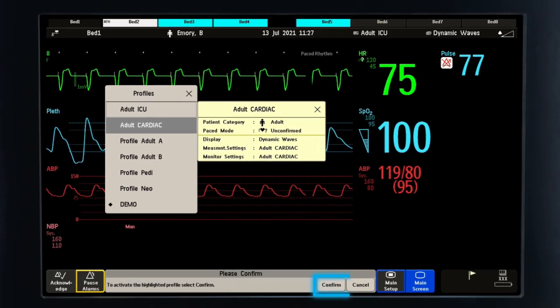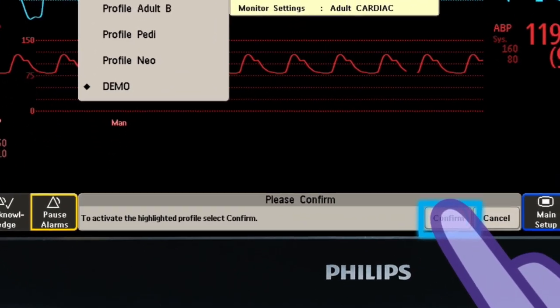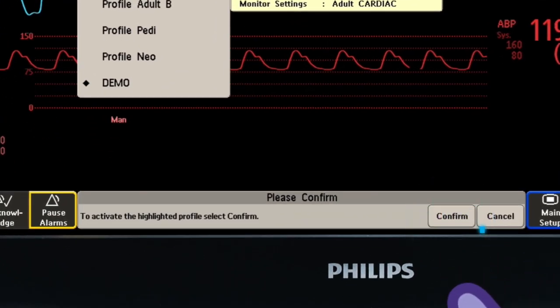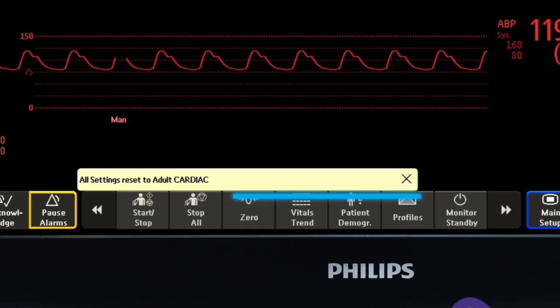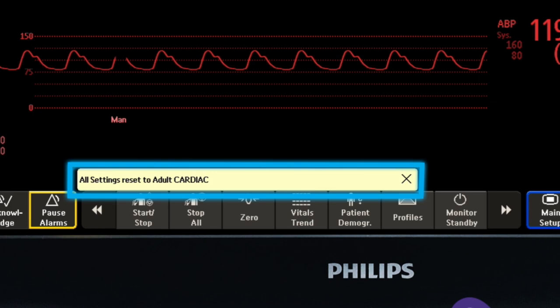When you change a profile, a message at the bottom of the screen notes that all settings are reset to the new profile. Note that your monitor has a default profile that resets when the patient is discharged.